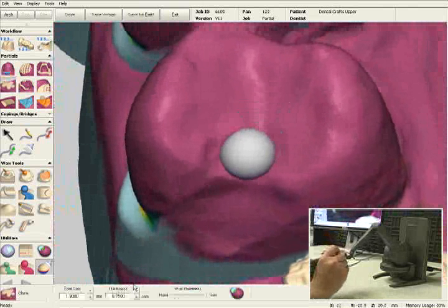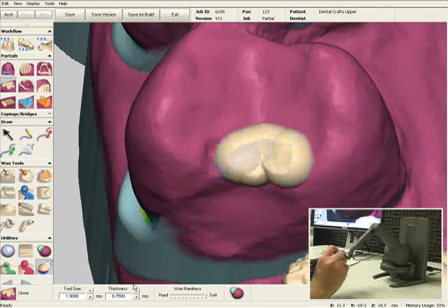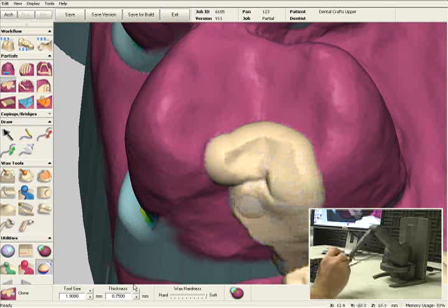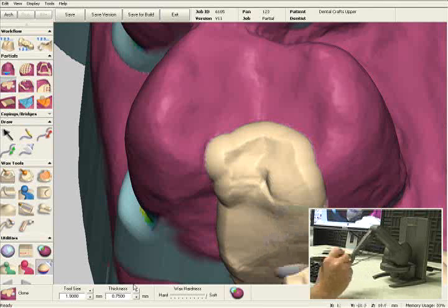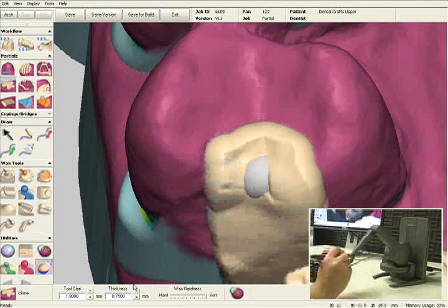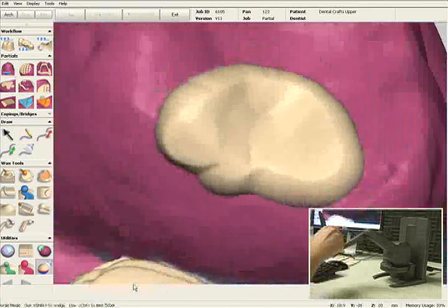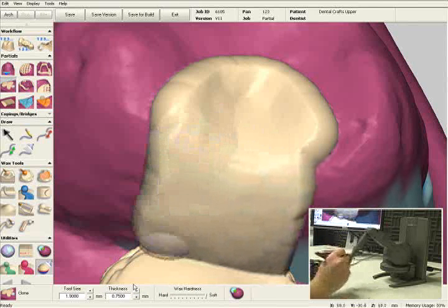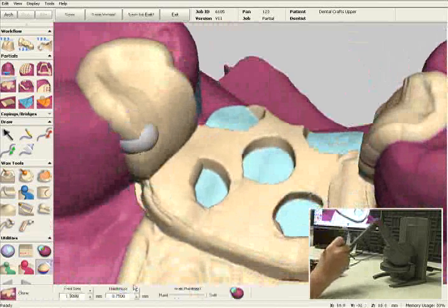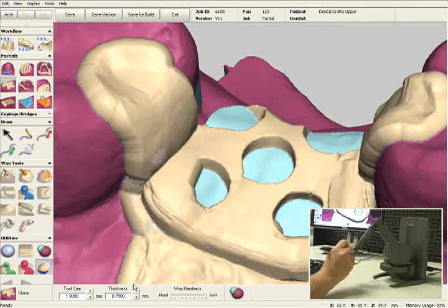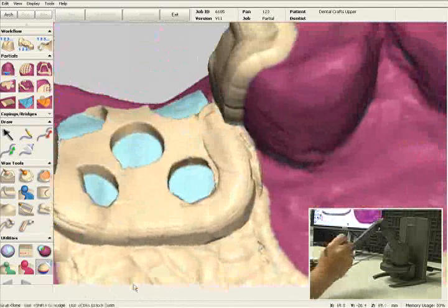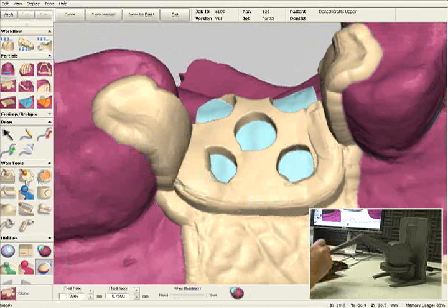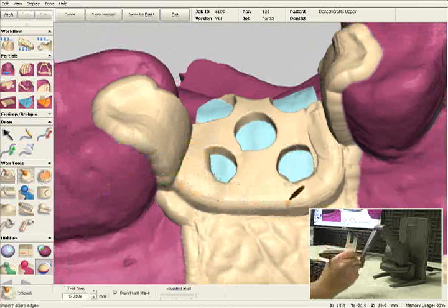Let's do the same thing for number 4. Let's add the guide plane, and let's add another guide plane on number 2. I'll select the smooth tool again and blend in some of these sharp corners here.